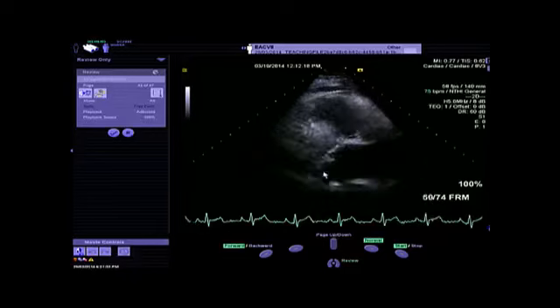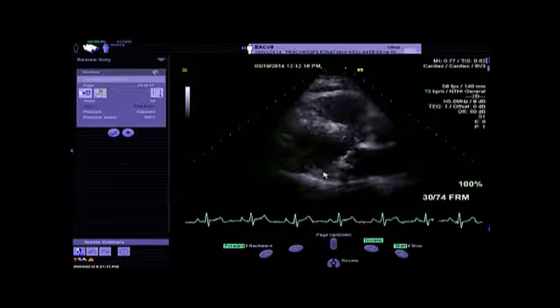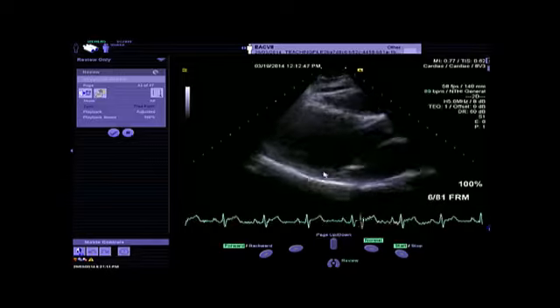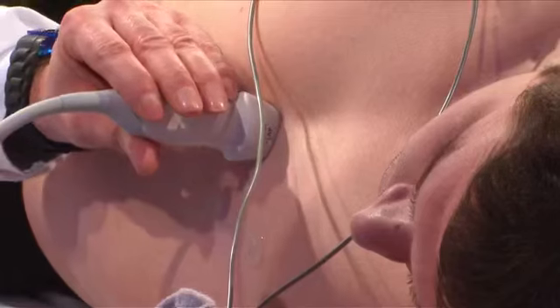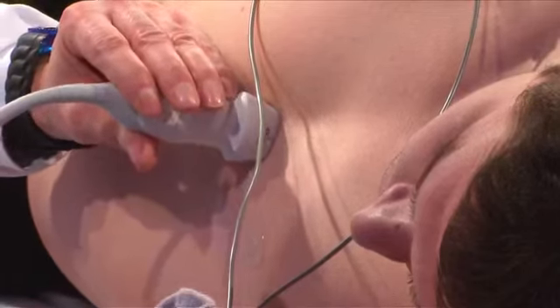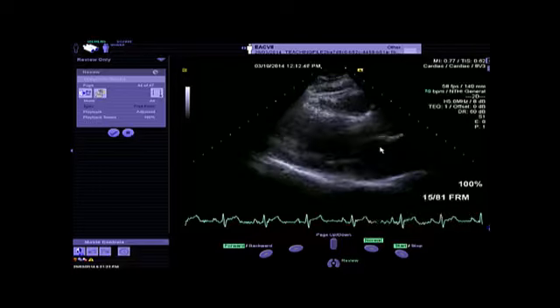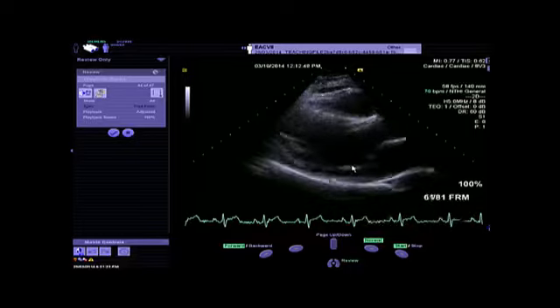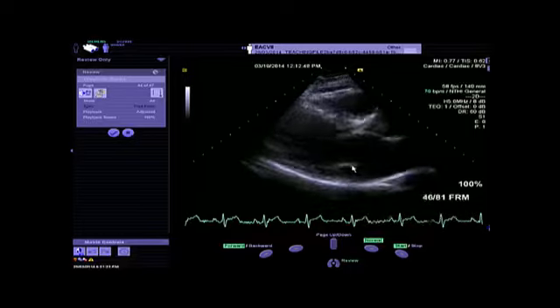But in these patients, it is obvious that it is a Barlow disease with an extensive mitral valve prolapse. The other way to analyze it is A3, P3, and for that you need to tilt the probe toward the internal commissure, and in that situation you can sometimes distinguish perfectly A1 and P1, but in this situation it's a bit difficult to get these images.